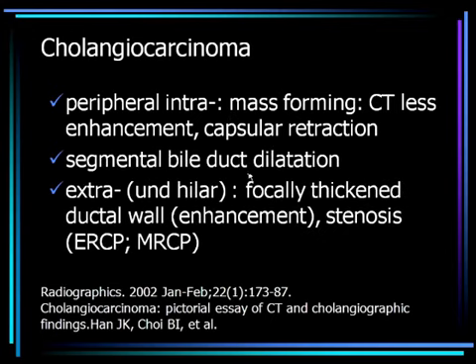We might have duct dilatation. And extrahepatic, the lesion is not a mass, but a stenosis. So, intrahepatic cholangiocarcinoma, a mass. Extrahepatic cholangiocarcinoma, not a mass, but a stenosis.